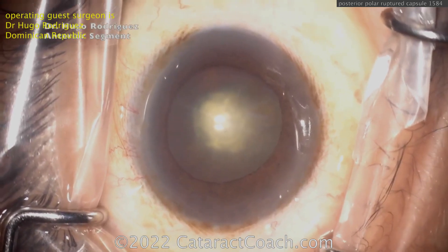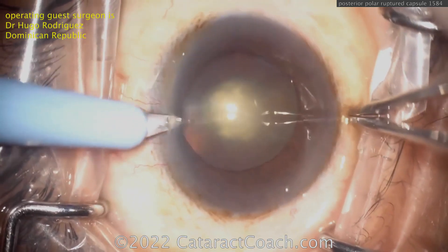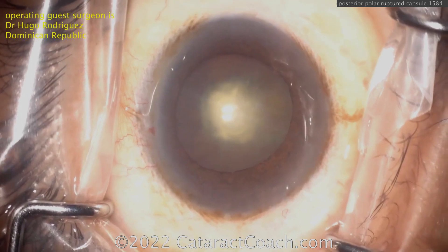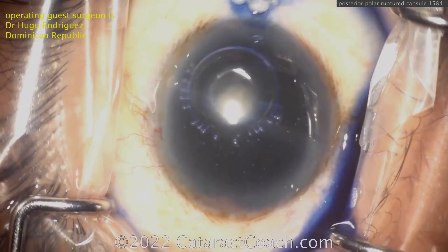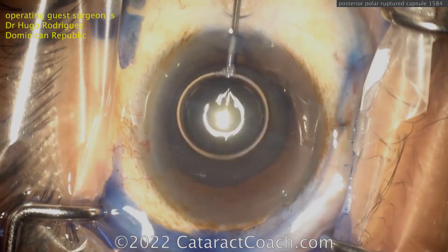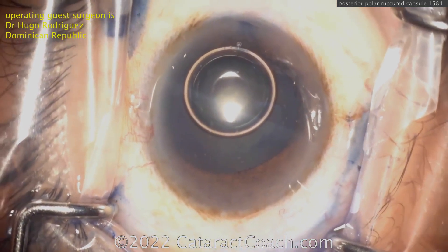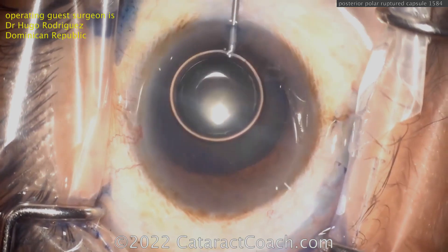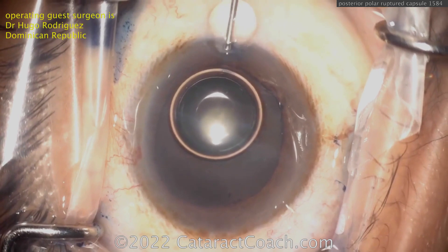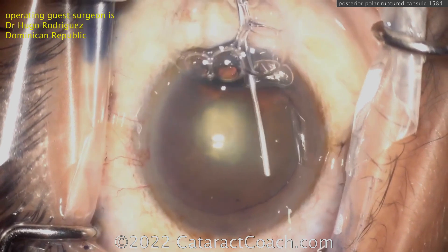Here's the posterior polar — definitely a posterior polar cataract. And making a paracentesis here. Now in a case like this, the posterior capsule is weak, fragile, or even frankly absent at the site of the posterior polar opacity. The best published studies from Robert Osher and Abir Vasavada have shown that about one out of three patients who have cataract surgery for a posterior polar cataract can end up experiencing a complication such as a rupture in the posterior capsule.